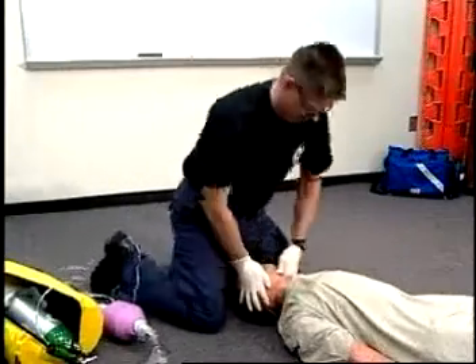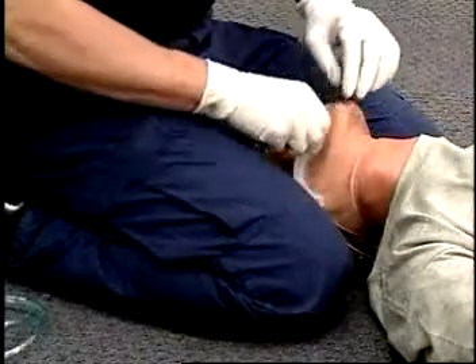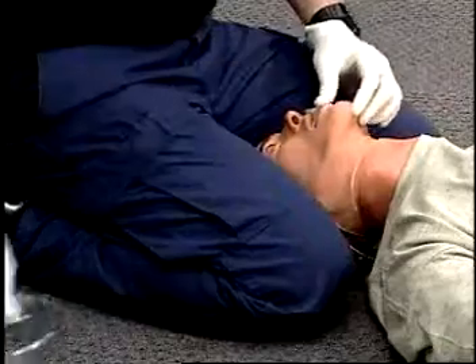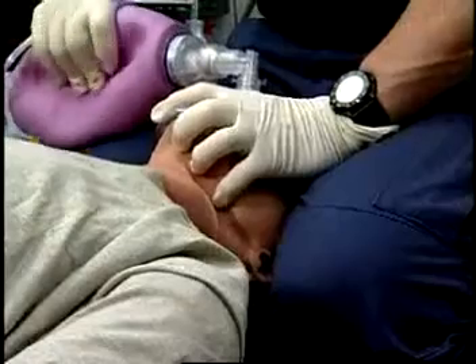Position yourself above the patient's head with one knee on each side of the patient's head with slight inward pressure. After insertion of the OPA, circle the mask with your thumb on the nose part of the mask and your first two or three fingers on the jaw part of the mask.